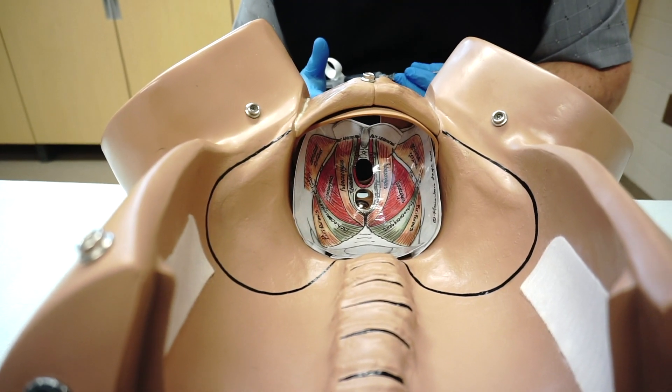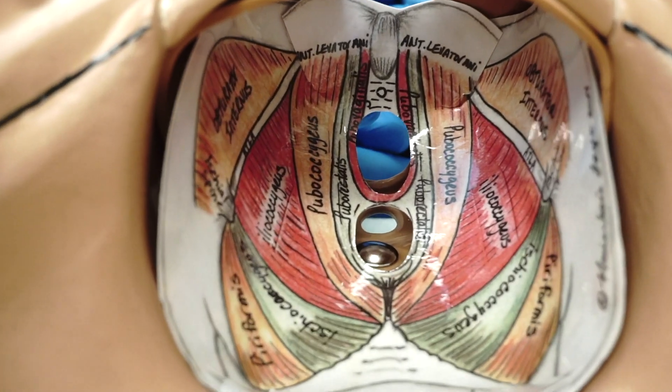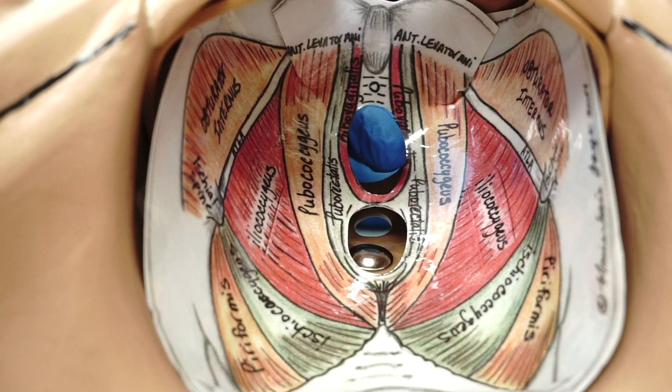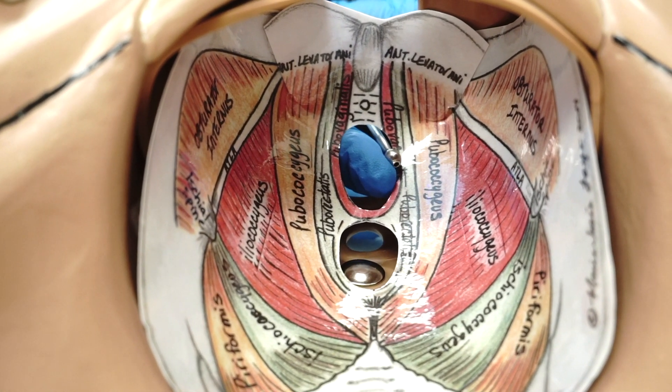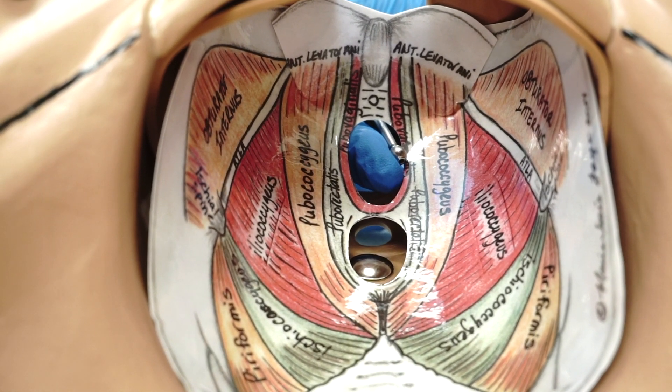We are going to inject the muscles closest to the vaginal opening. I'm introducing my fingers through the vagina and the first muscle is pubovaginalis. One to two cc of solution is injected into each muscle group.